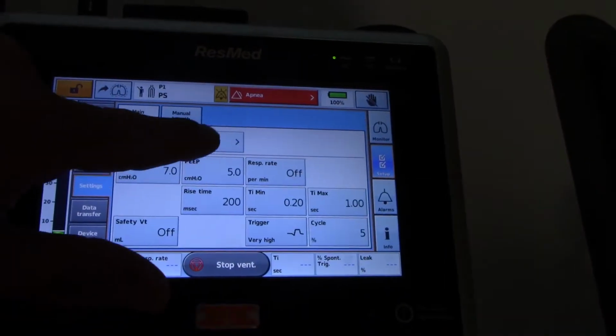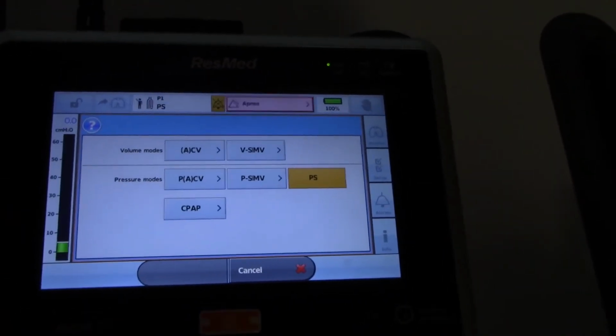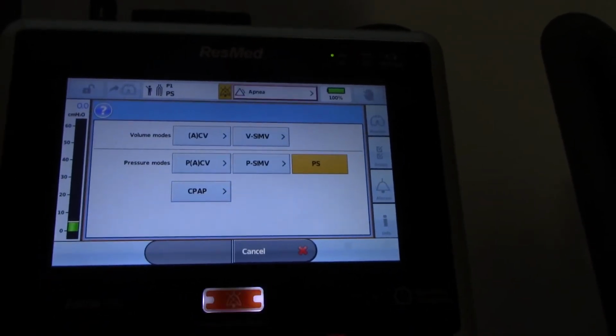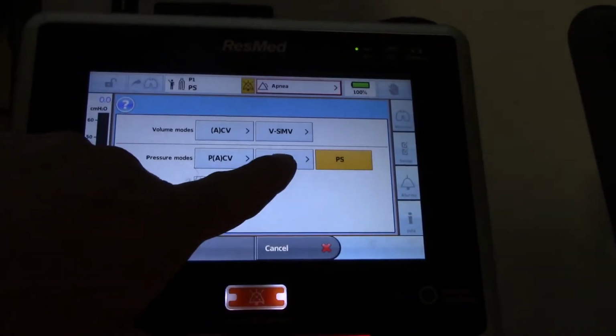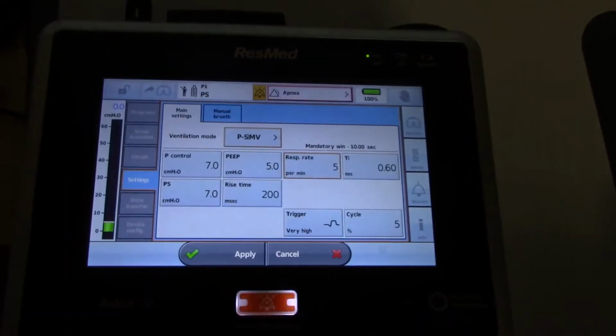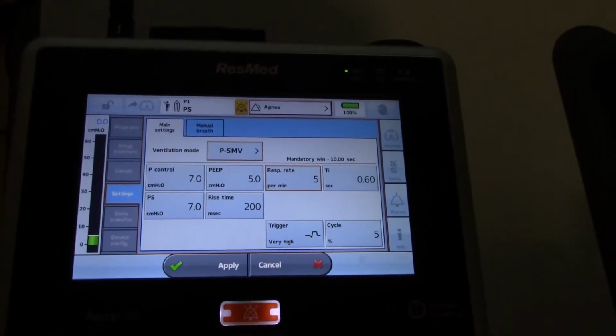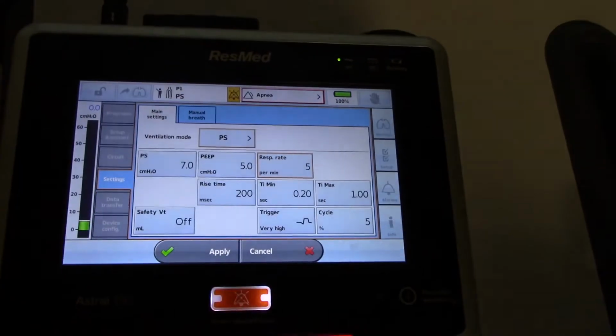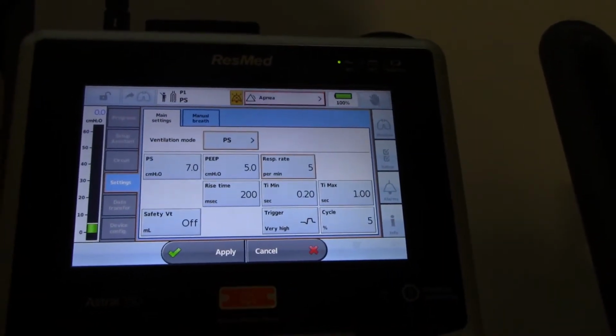Here is the mode option. So I'm going to hit this. This gives me the available modes. Now, the only two modes that we're going to use, or we're going to suggest to use, is PSIMV, which is equivalent to SIMV pressure control, pressure support, or pressure support, which is equivalent to CPAP pressure support.